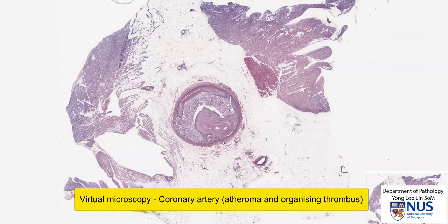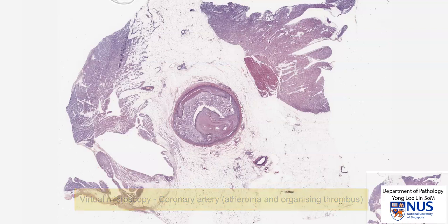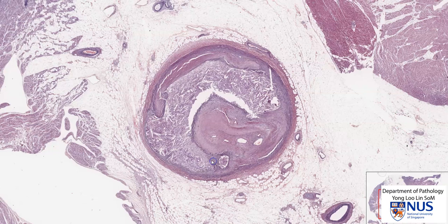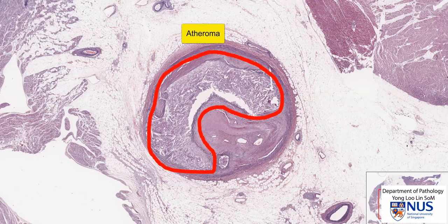The pathology that we're going to focus on is in this coronary artery, and it's actually a very abnormal artery. What's left of the lumen is actually over here, and this entire area here is a large atheroma.